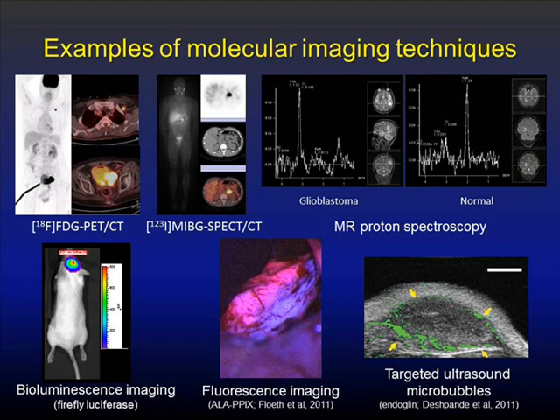So the main thing is not to understand every bit of this, but molecular imaging encompasses a wide range of disciplines. And depending on the clinical problem or the clinical question, you may want to choose one or more of these.